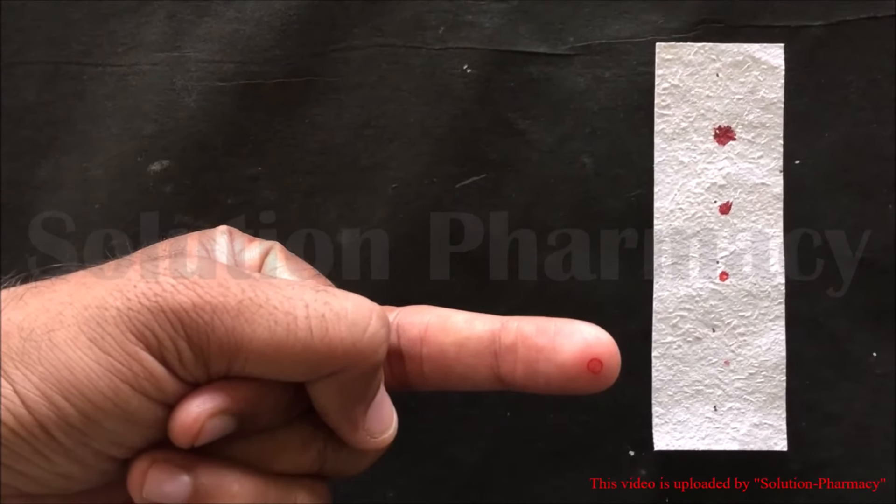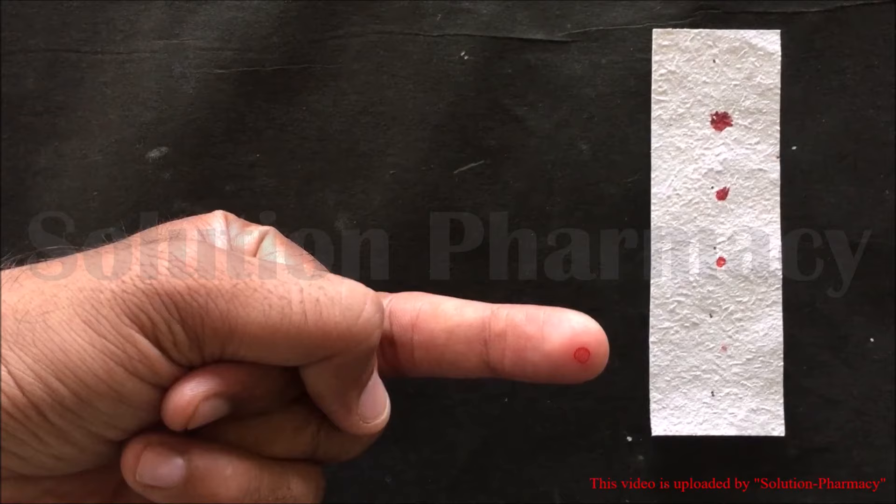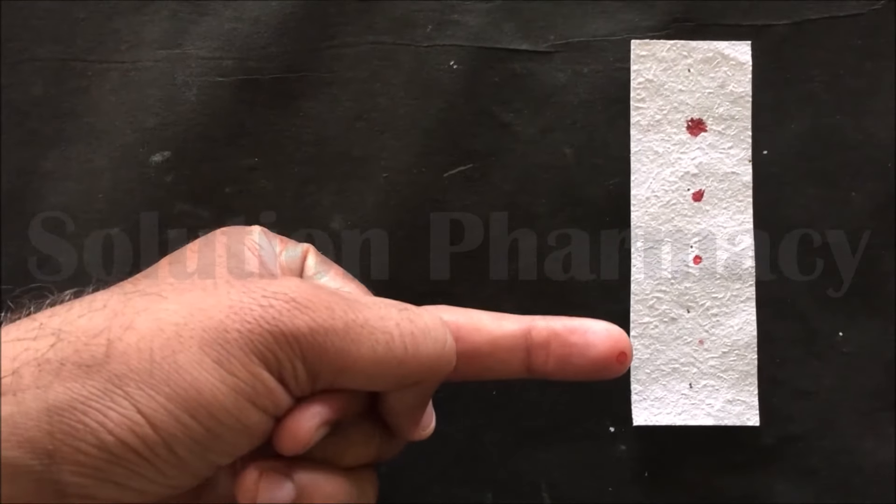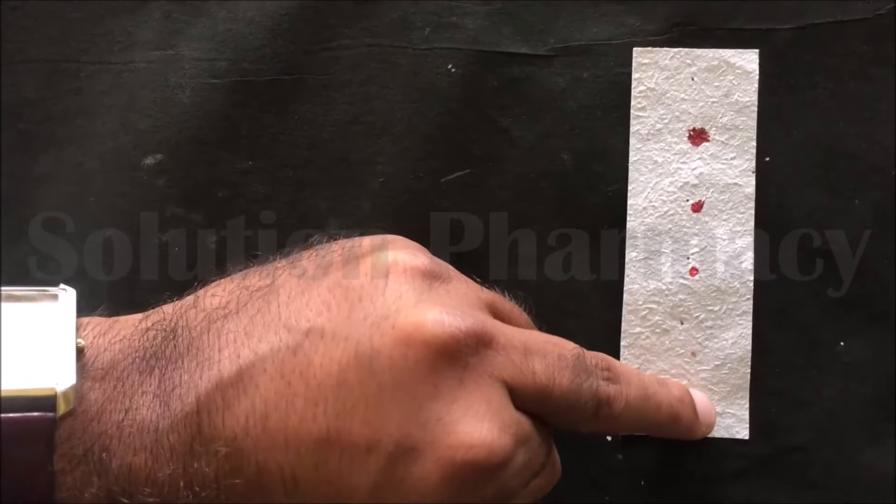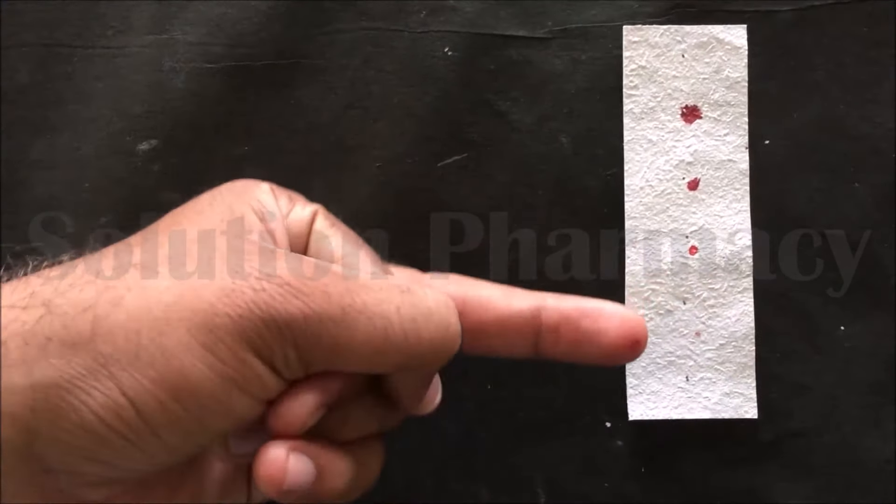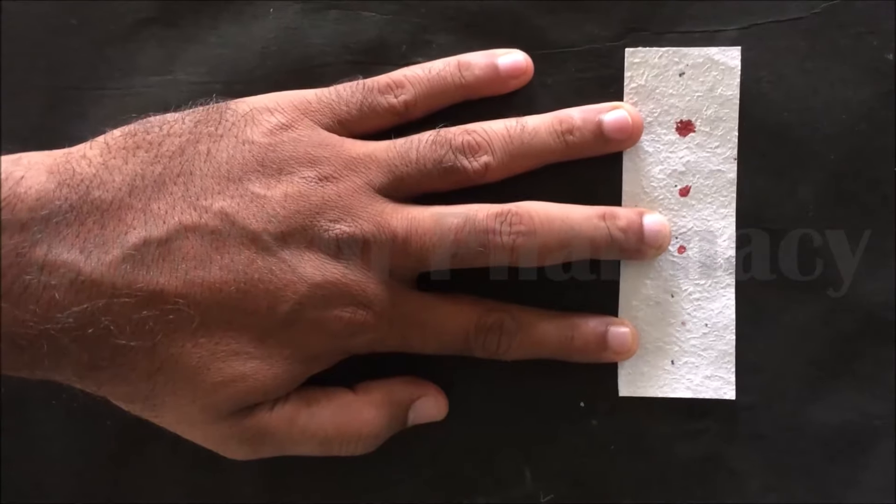After 30 seconds, touch the fingertip gently on the filter paper. You can clearly observe here that there is no spot or stain of the blood on the filter paper appearing. This time is known as the bleeding time.